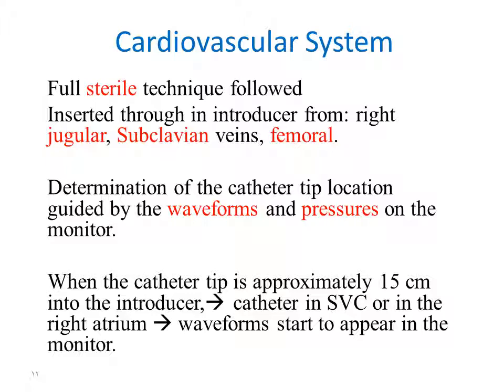So at this point the waveform starts to appear on the monitor. يعني بعد إدخال الكاثيتر تب ب 15 سنتيمتر داخل الجسم تبدأ الويف فورم بالظهور على المونيتور.